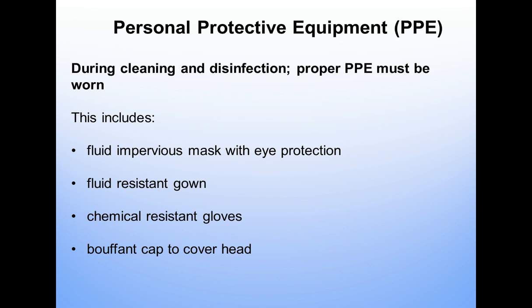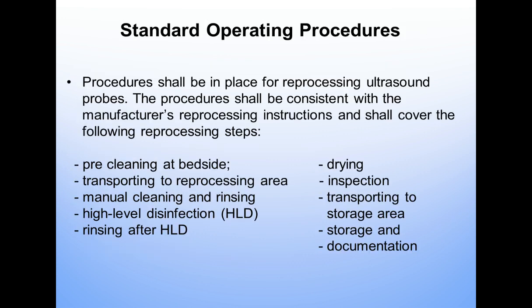So you cannot wear the same. You have to have a cover up. You cannot be going from the patient into the reprocessing area with your uniform on. You have to wear proper PPE as required.